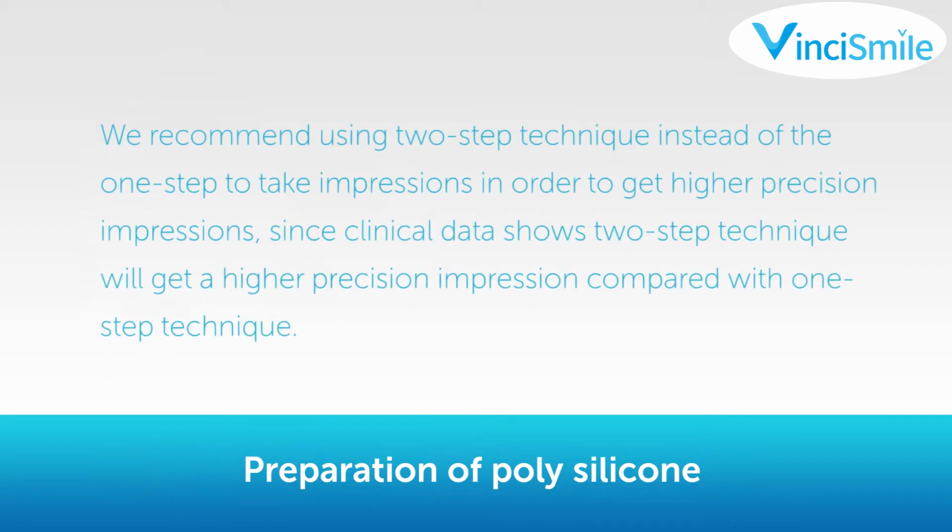We recommend using the two-step technique instead of the one-step to take impressions in order to get higher precision impressions, since clinical data shows the two-step technique will get a higher precision impression compared with the one-step technique.